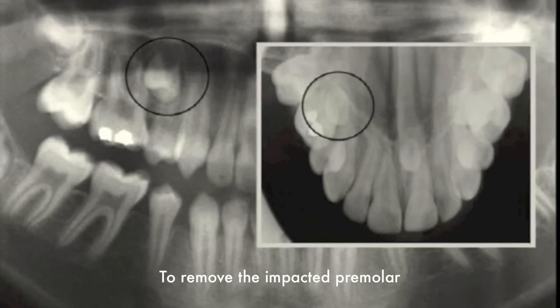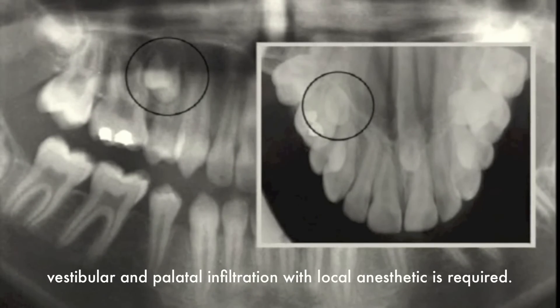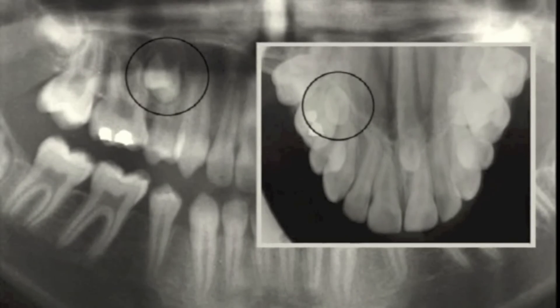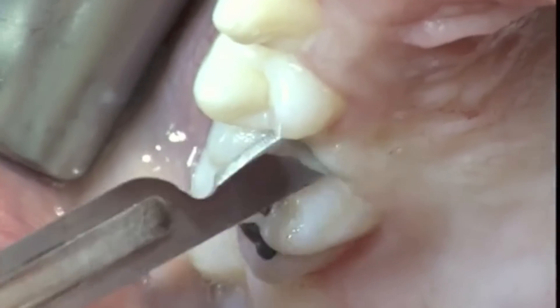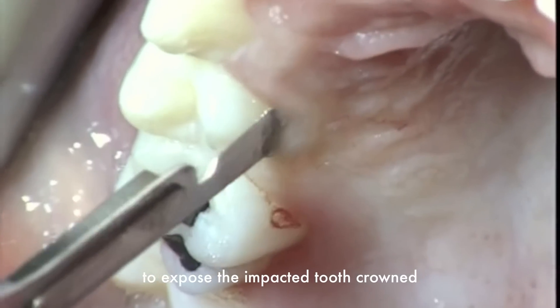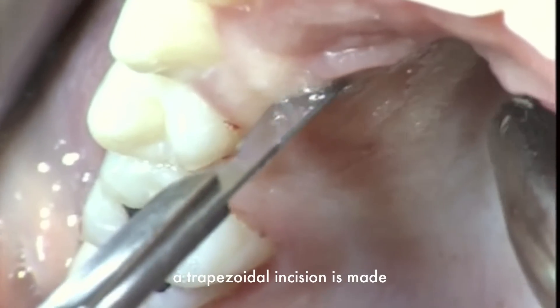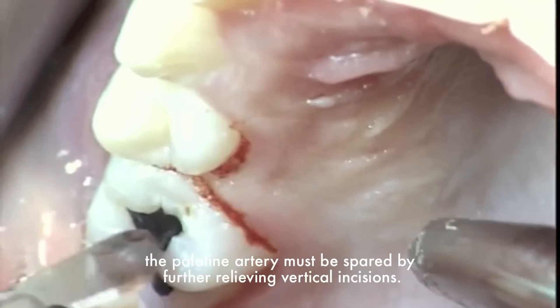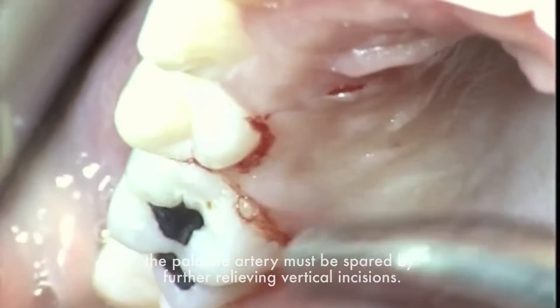To remove the impacted premolar, vestibular and palatal infiltration with local anesthetic is required. To expose the impacted tooth crown, a trapezoid incision is made. The palatine artery must be spared by further relieving vertical incisions.